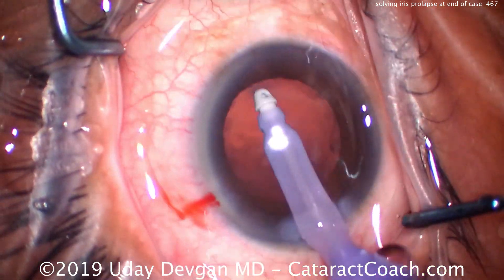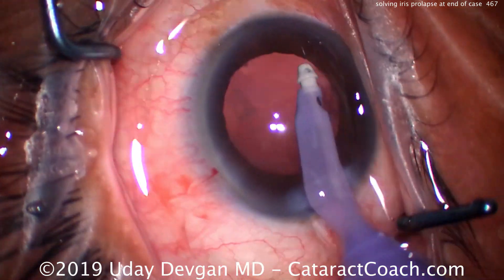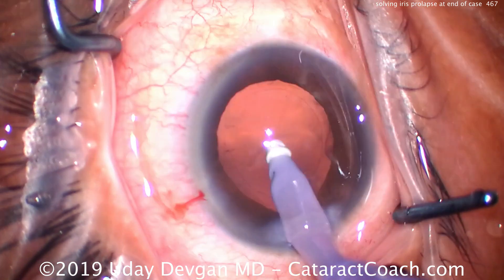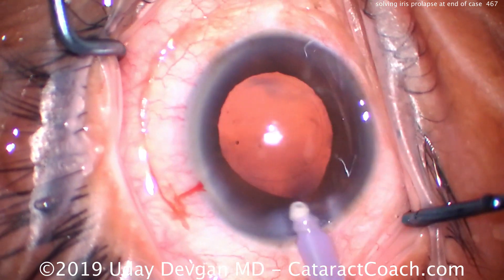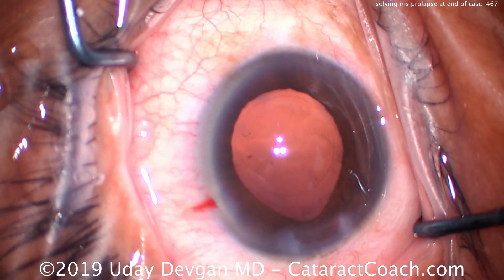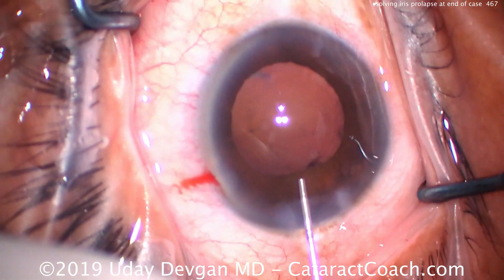Now let's go to the end of the case — cataract removed, cleaning up the capsular bag, a little bit of polishing of the anterior capsular rim. That looks great. This is where we're going to end up having a little iris prolapse. Again, cleaning up the capsular bag, polishing the rim — looks great. There's a little iris prolapse; look at the incision there.